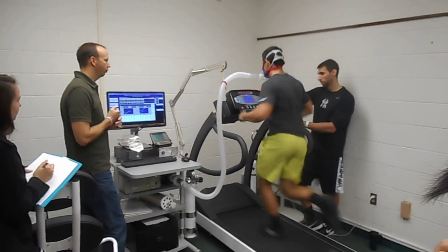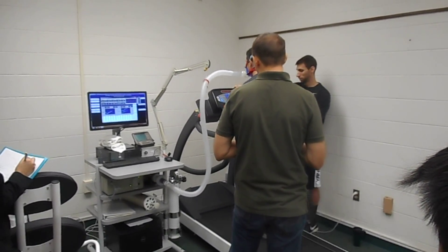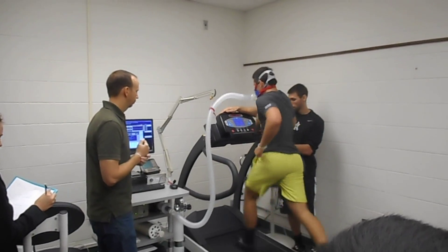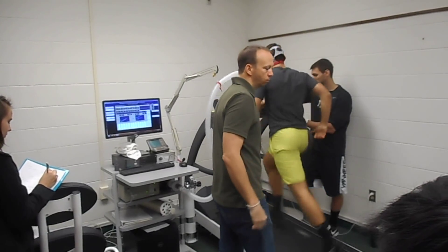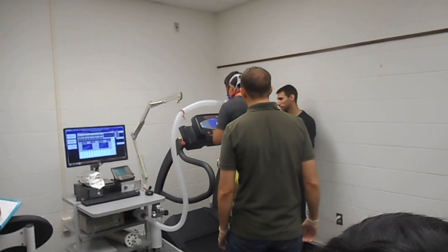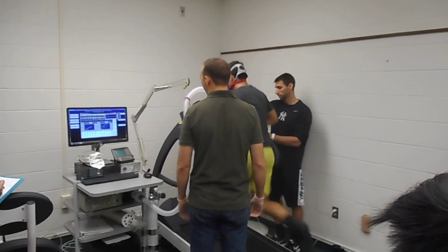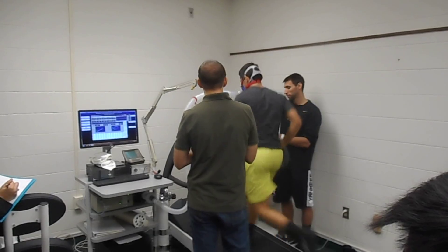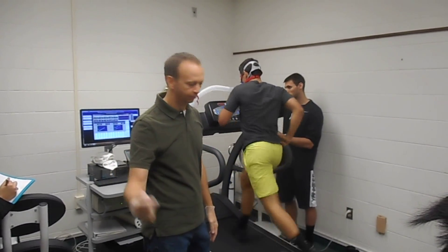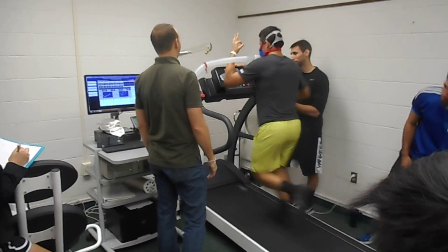On the zero-to-ten scale, Zach reports a six. Heart rate is at 174. He's given a one-minute warning signal. VO2 is continuing to climb. His exertion is now eight on the scale — three above five. The class cheers him on, encouraging him to push through the final seconds, noting that Seth's number of 53 is within reach.